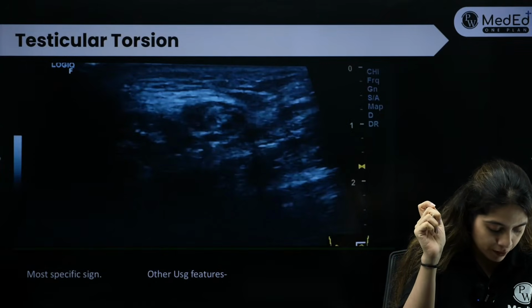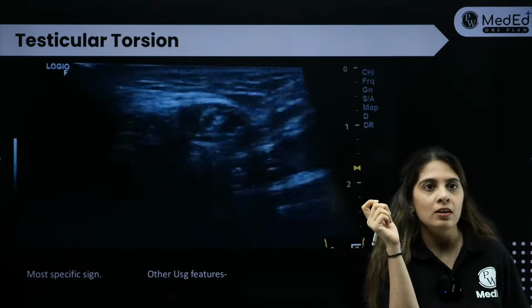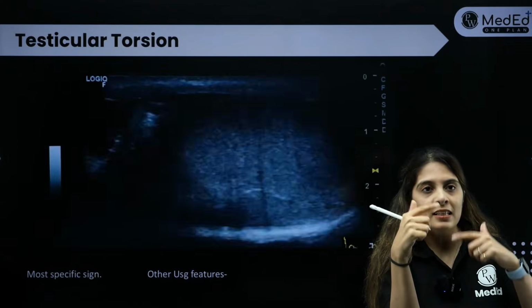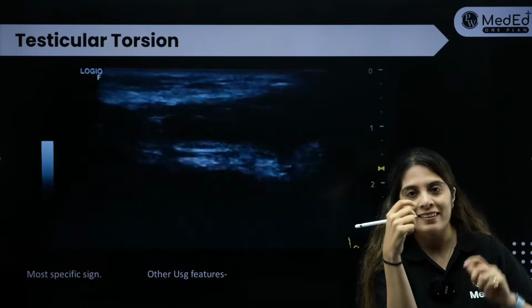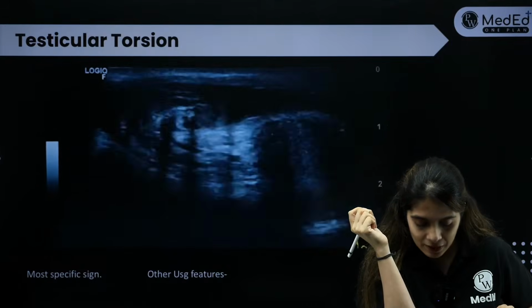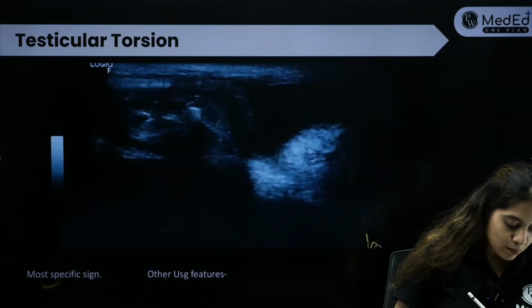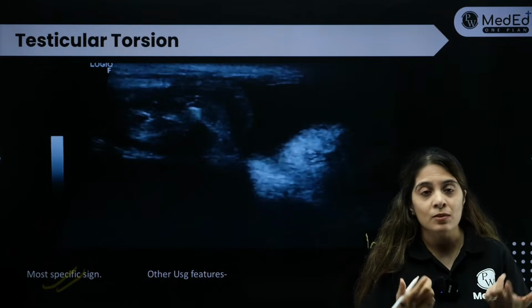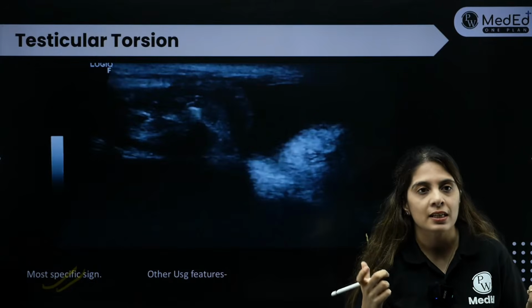I have got one more video, so you can see this video again. Okay, can you see this particular video? You can see how well the spermatic cord is twisting around, right? I hope that you are able to appreciate this particular thing. Yes, Ankit, right? It is C. So Whirlpool sign, I would say, is the most specific sign that you will be appreciating in testicular torsion.